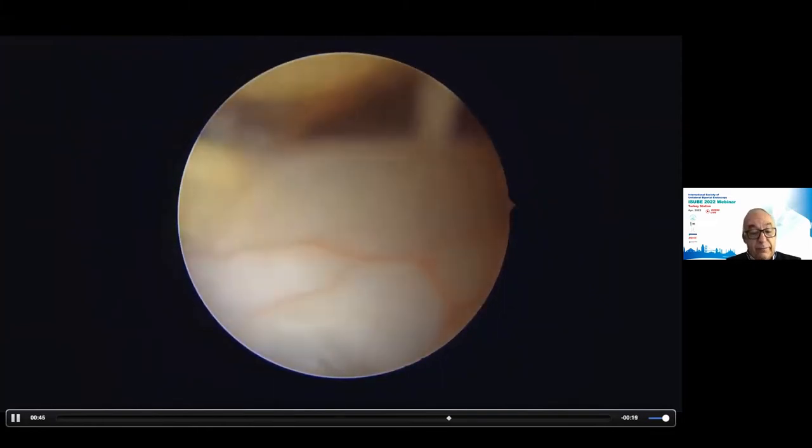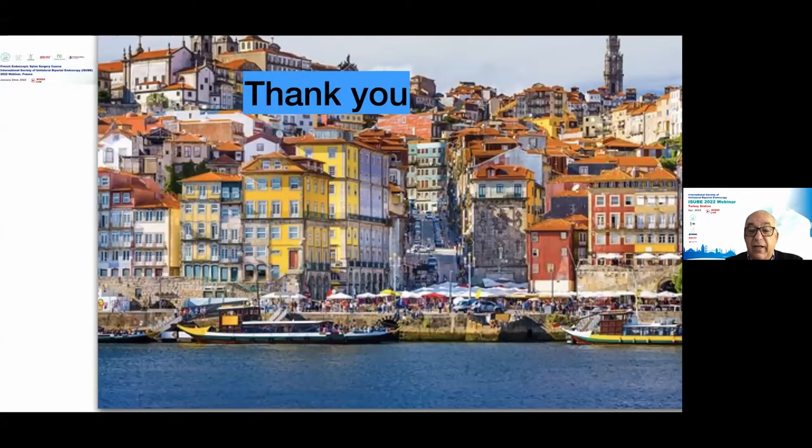In conclusion, most of us neurosurgeons do not have training in endoscopy. For those who have microsurgery training, it can help. The image is similar, but the focal length is completely different. In endoscopy, you have an image that is right on top of the target, giving the feeling, for example, that we are drilling a little, but when we confirm with the X-ray, we come to the conclusion that we have done much, much more.